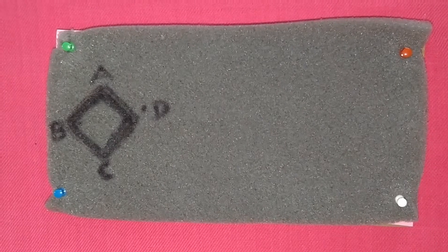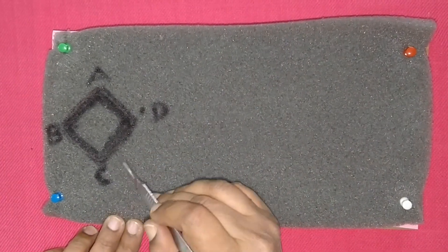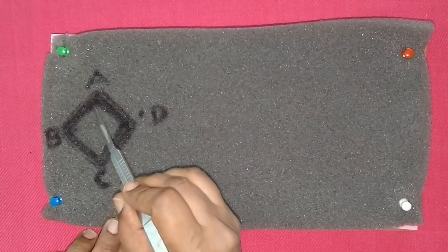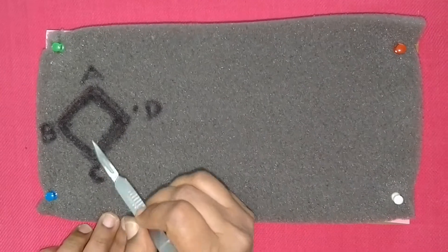A defect A, B, C, D has been created which is rhomboid in shape. When we say rhomboid flap it refers to the flap covering a rhomboid defect and it does not mean that the shape of the flap is rhomboid.